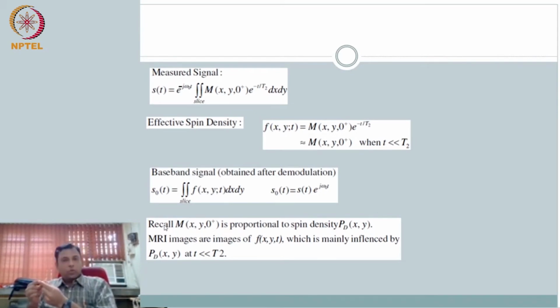If I have a bigger slice thickness, I will have more volume, like the imaging plane times delta z, and I will have more signal. That mxy that you are measuring, the S of t that you are reading out, will be high if you have a larger thickness. It will be low if you have a thinner slice. That's what this intuition tells, right?